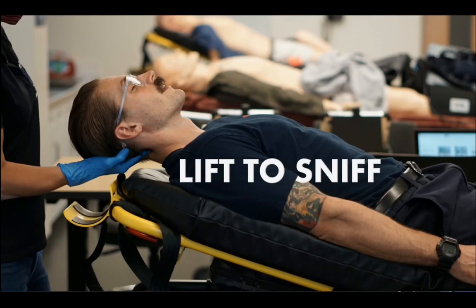So again, don't stop with just occiput off, but elevate the head. This is the point in which I'd slide a towel roll right under that head. You can see in this picture we have this great ear to sternal notch alignment. And we're talking about the ear hole, or the external auditory meatus, if you want to get nerdy with it.